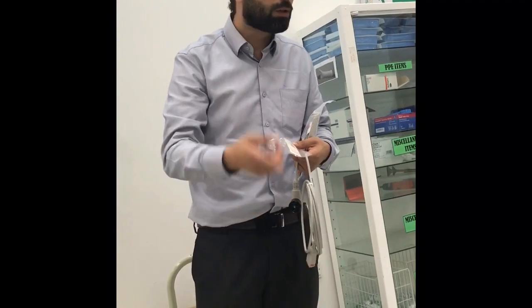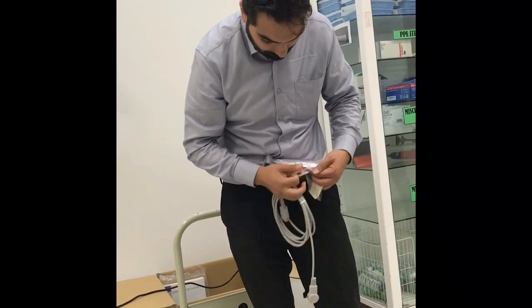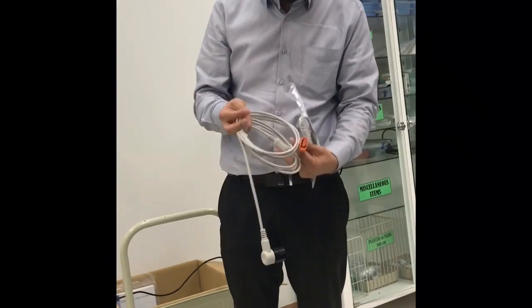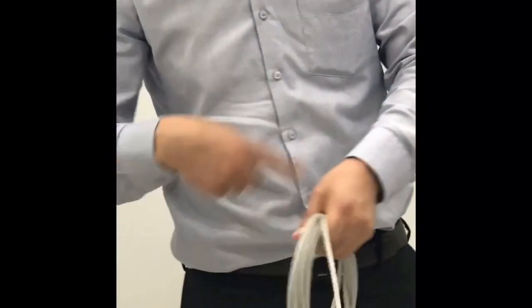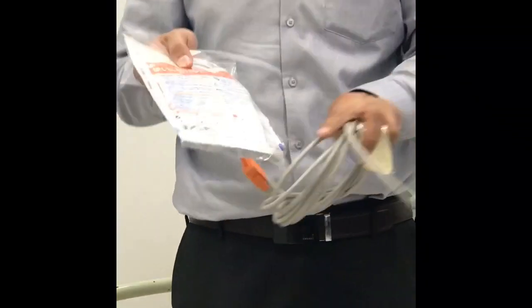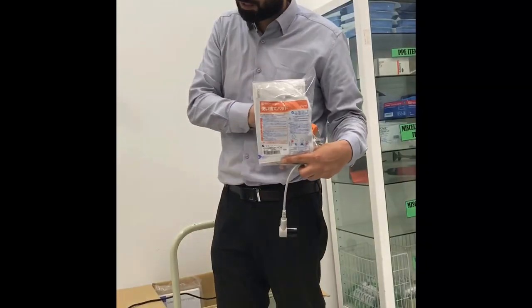Okay, I will open it from here only. Don't worry, just to reconnect it. Okay, so I have a complete set now. This pad can be used for adult and child, the same pad. Adult: lower left, upper right. Child: front and back, in case I don't have space on the chest.